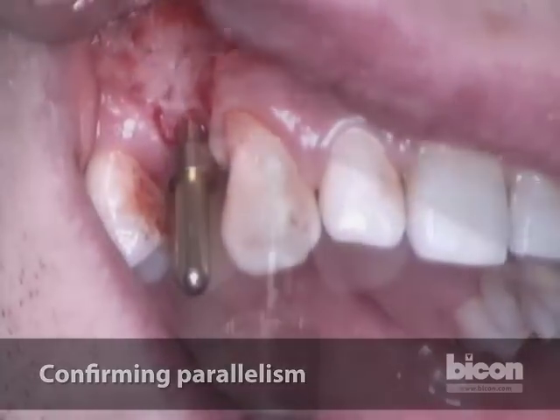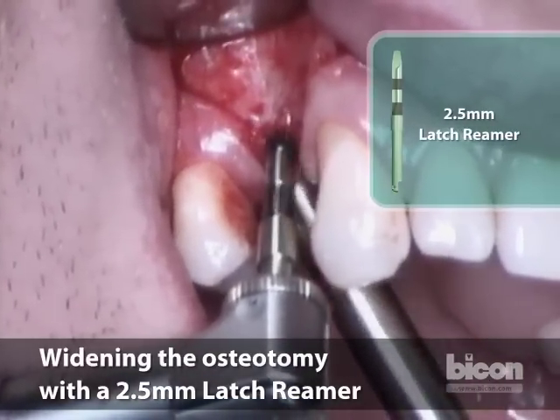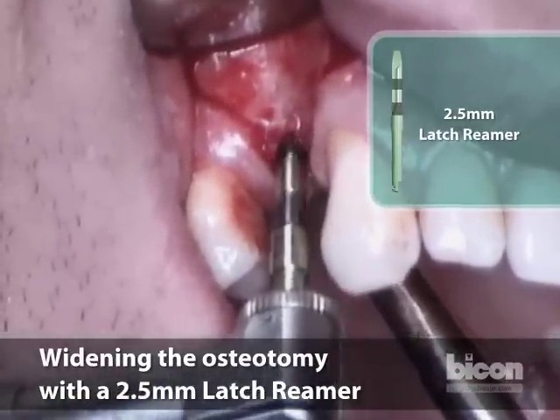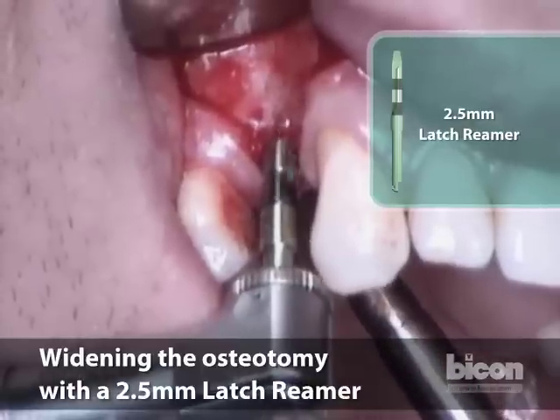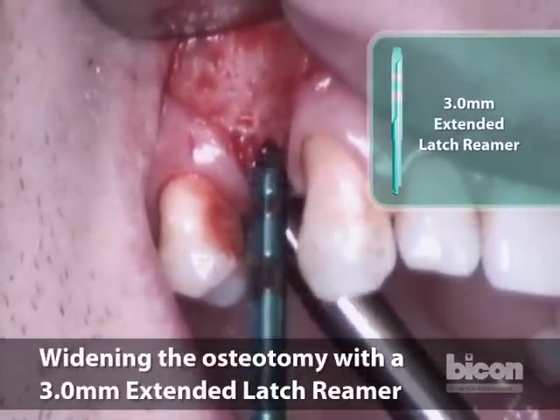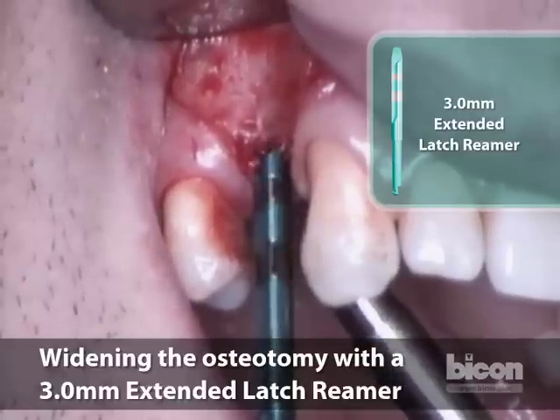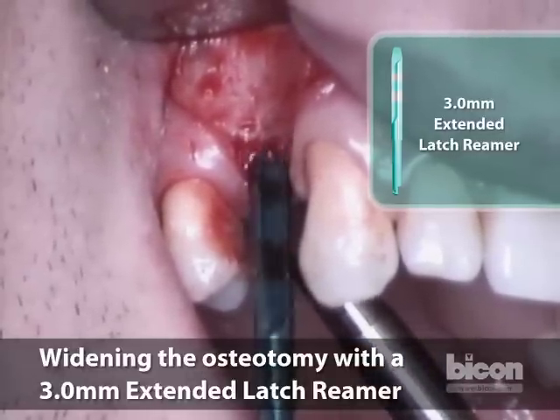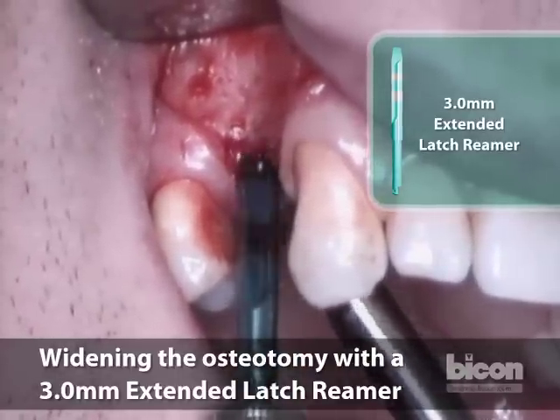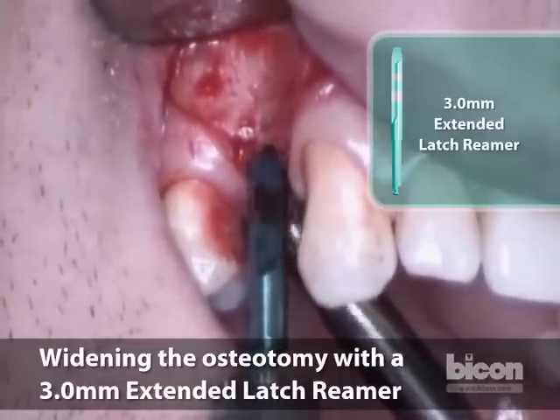We have corrected the angulation. This is 2.5 millimeters. We are at a depth of about 8 millimeters, and this is about 9. The first band begins at 6, the second at 11. The first band is between 6 and 8; the second is between 11 and 14.